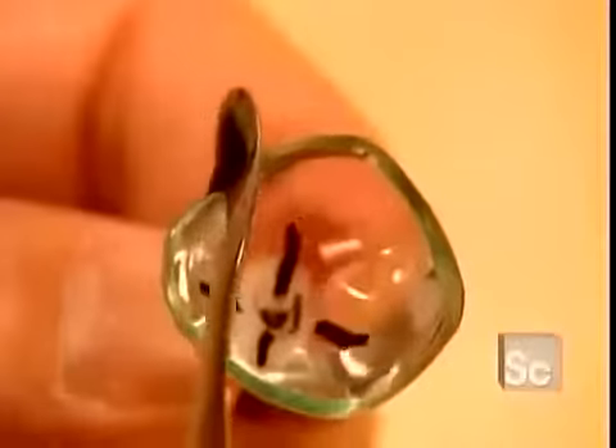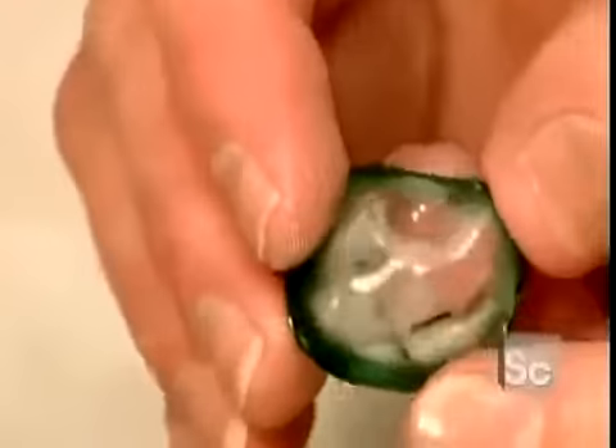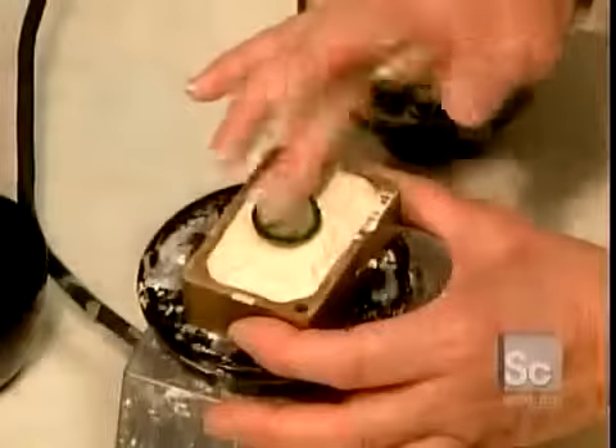This excess will give the ocularist some room to work with for the final sizing. Now they take this marked and enlarged fitting shape and make a plaster mold. They'll later use that mold to cast the actual artificial eye. But first, they have to make the iris.